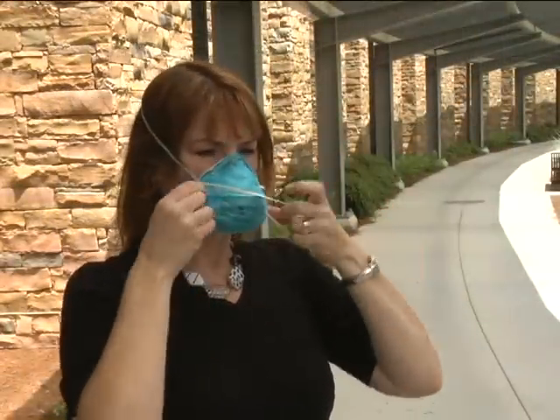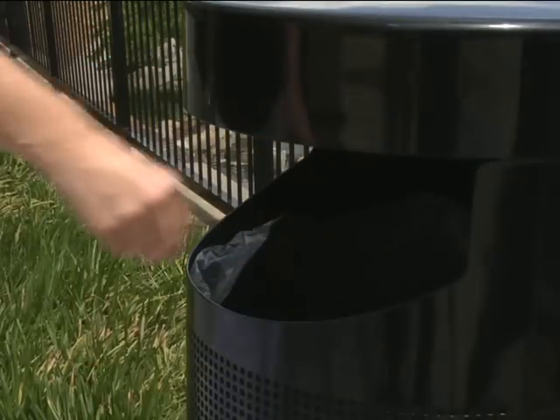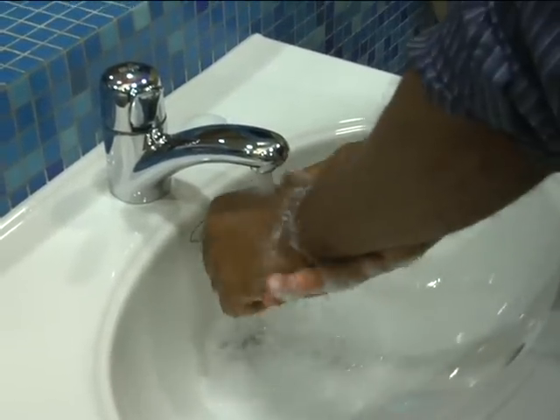When you're finished wearing the respirator, carefully remove it using the straps. Discard your respirator by carefully placing it in a waste container. Wash your hands immediately after handling the used respirator.